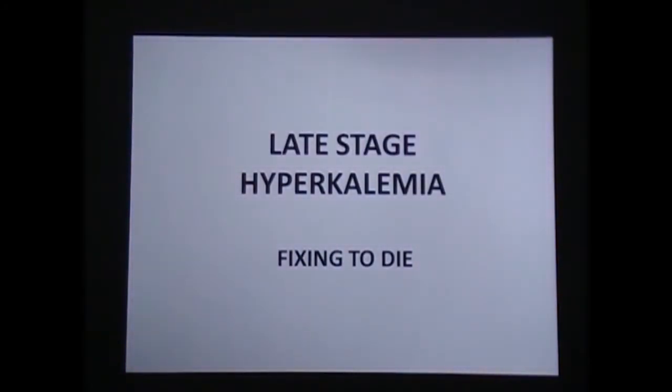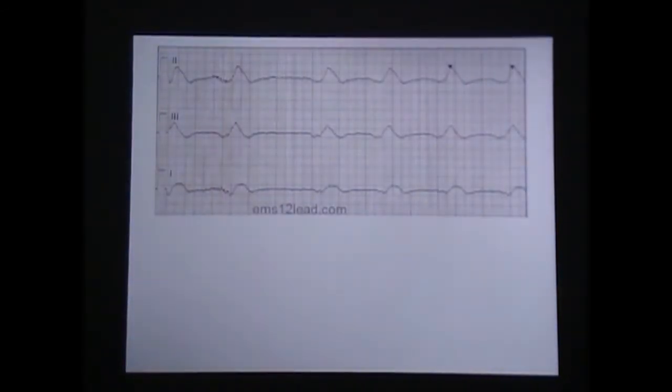And I saw a great sine wave EKG that came out of a hospital near a naval air station, and the EMS had looked very similar to this. EMS had given amiodarone and all those kind of things, thinking it was a wide complex tachycardia, but it was not tachycardia, it was a bradycardia.